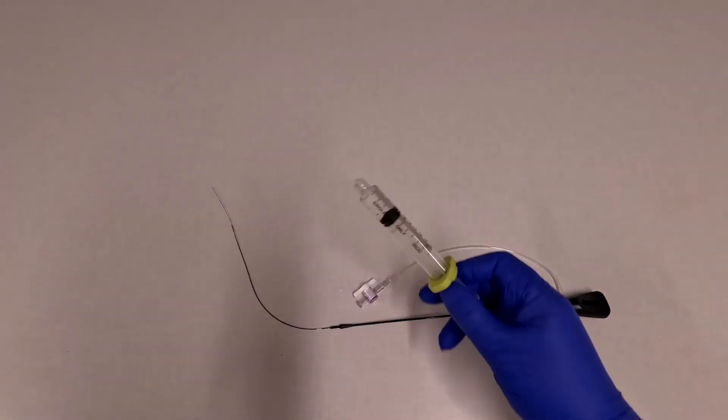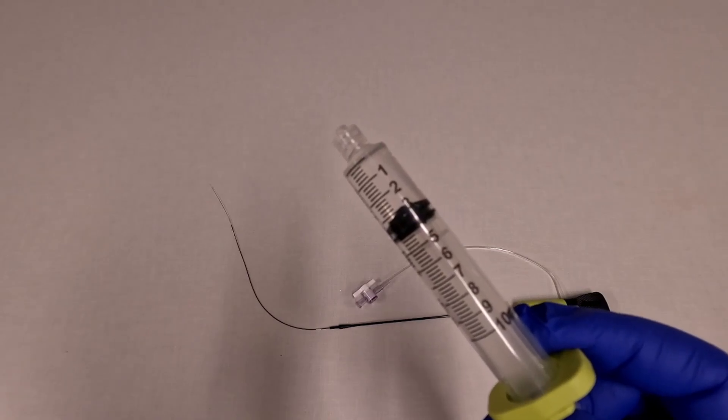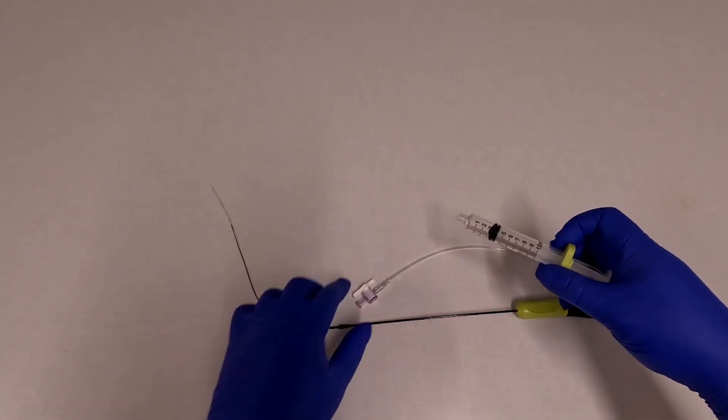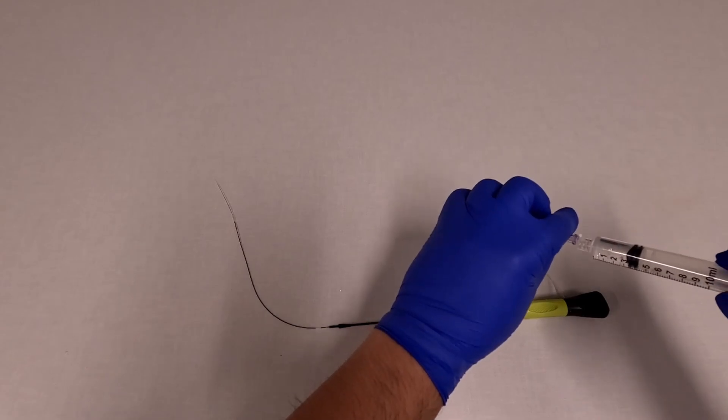To get prepared, you want to fill the syringe with about 3 cc's of saline or contrast, and then you're going to hook it up to the back portion of the device.